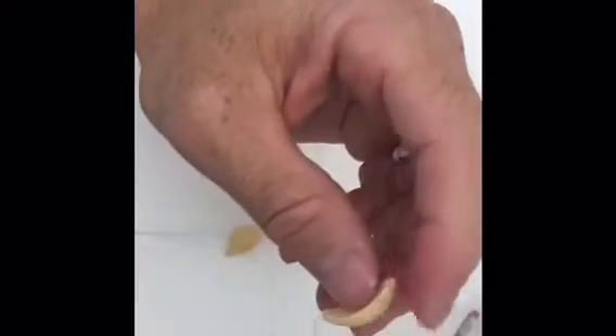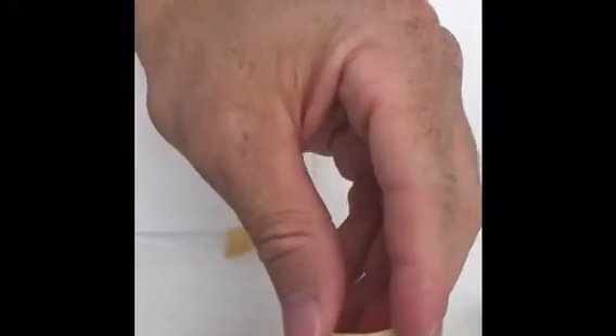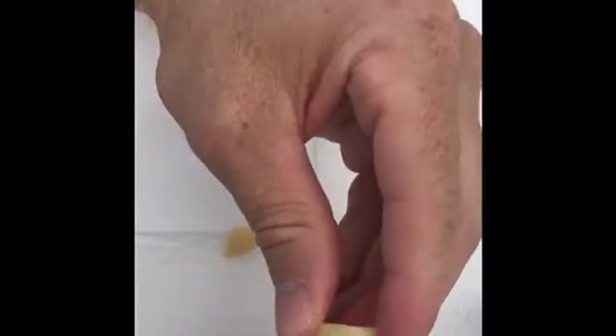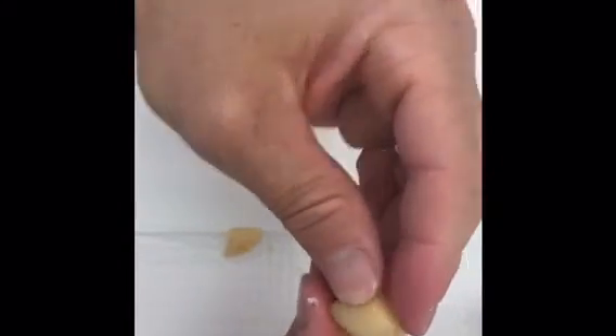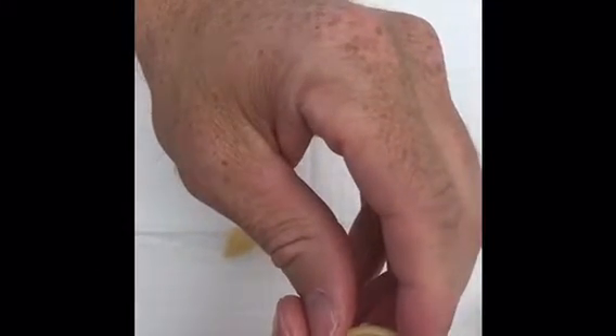Most likely you'll just be making it thinner, so you just scrape away material to make it thinner. If it's falling out or looks too open, you can start taking material out from the posterior right along here at the bottom.